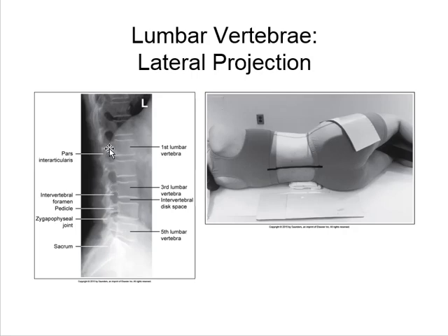That's going to put you right at the back of the body, but pretty much right dead square in the middle of the vertebra. Regardless of how big the patient is, put that line of collimation going straight up and down through the peak of the iliac crest, and you're usually going to be good, unless you have a patient with a really great lumbar curvature, or if you're intentionally shooting flexion extension views.